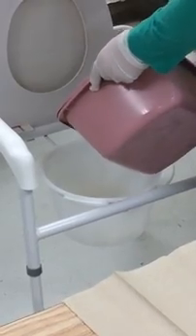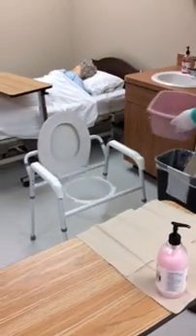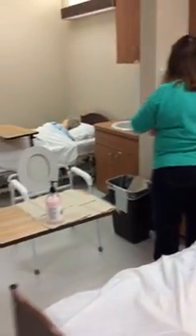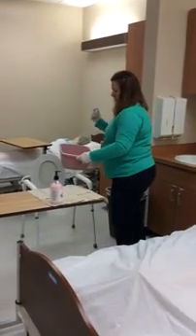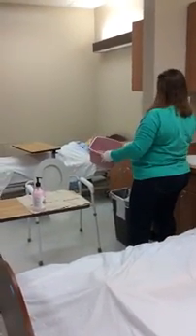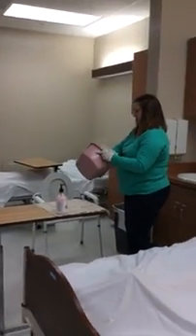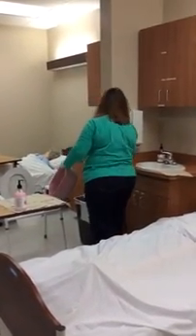Make sure that when you're dumping your water in the toilet, that you've got your basin far enough above it so that they don't think you're resting it or tapping it on the toilet edge. All you have to do is just put a little bit of water in your basin. You don't have to swish it around underneath the sink, because then you're going to end up hitting the basin on your sink. You can swish around here if you need to. Don't spend a lot of time swishing it around, because this is a simulation. It's not real perineal junk that you're cleaning. But you do have to make sure that all of your equipment is dry before you put it away.